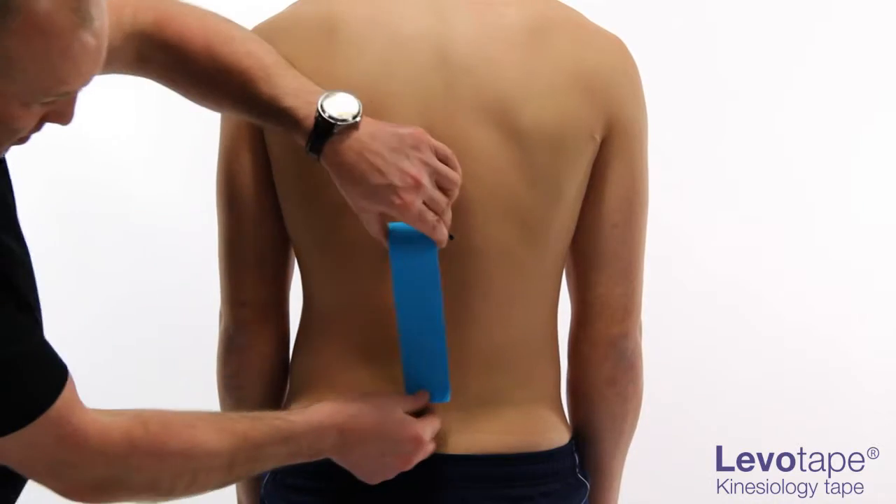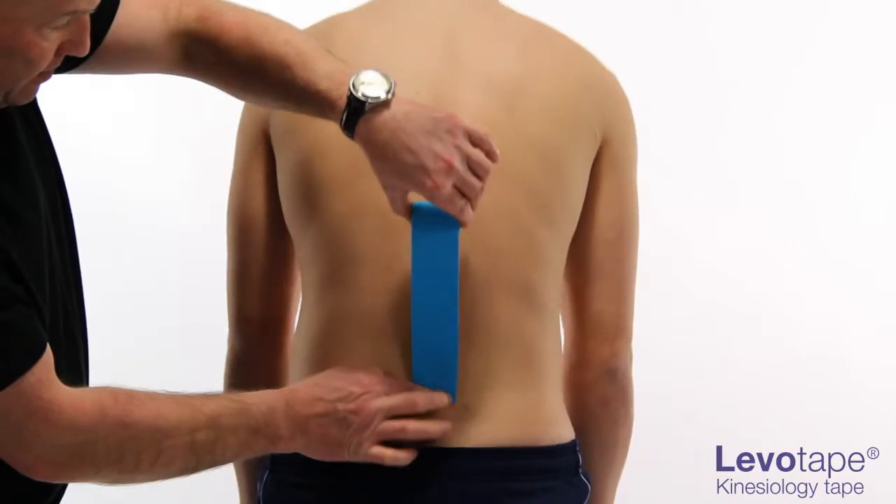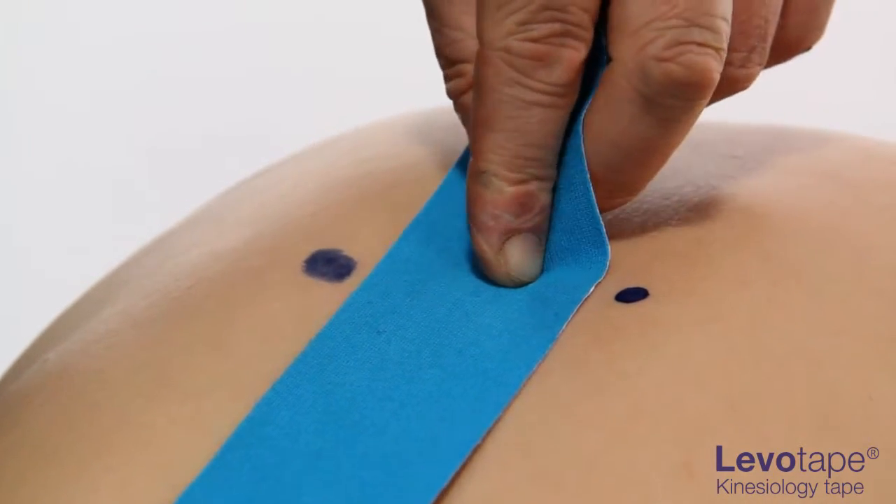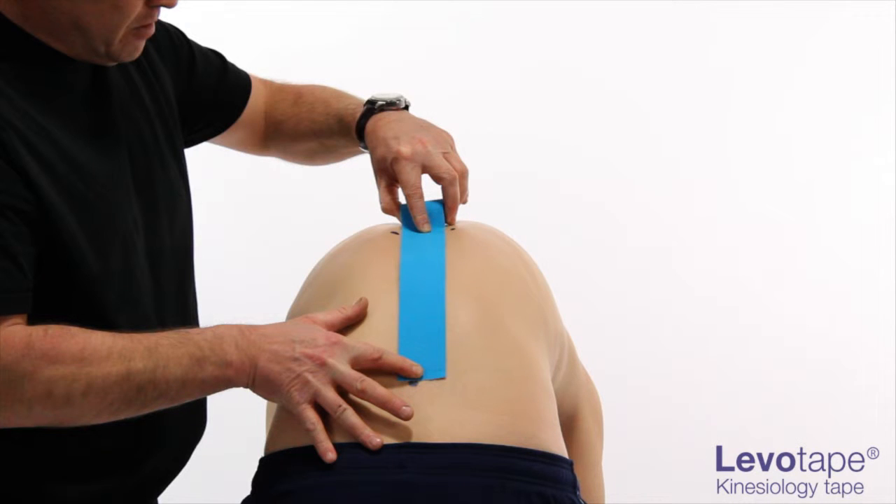Because this muscle lengthens considerably more than other muscles when in flexion, measure the tape with the patient in maximal achievable flexion. This will ensure the tape covers the entire muscle length.